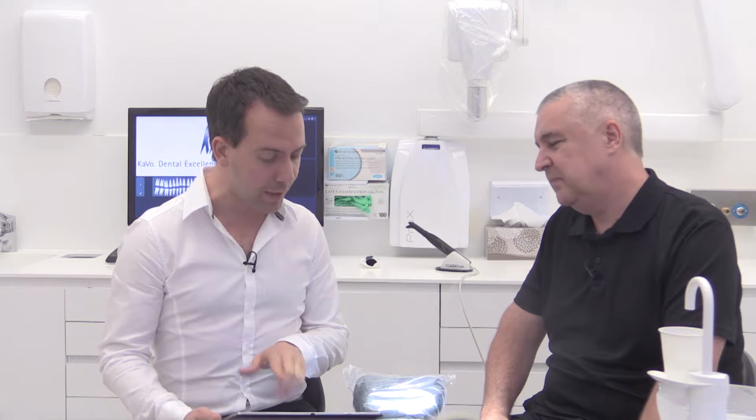So we've had a question here about under which situations could we expect false positive results, and I guess that relates to what you've already talked about. Yeah, probably the main area I see false positive results as a problem is when patients have a lot of dietary stain in the fissure system, and a lot of our patients do have lots of highly coloured foods. If we go through with a particle jet cleaner, we can easily clean all that material out. And of course, if we're using another fissure caries diagnostic tool, such as a DIAGNOdent, that stain is also going to cause a false positive for that too.